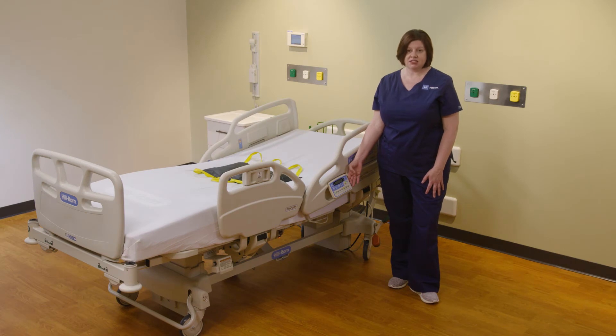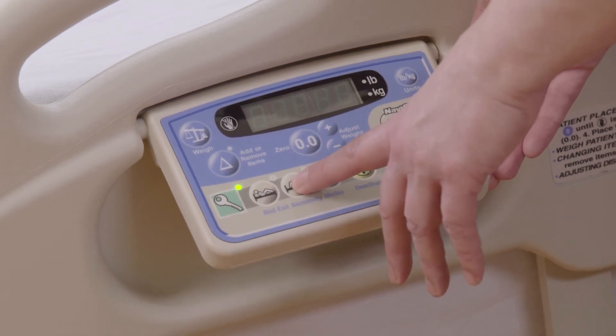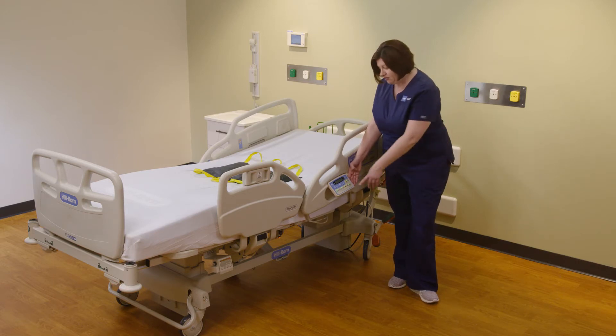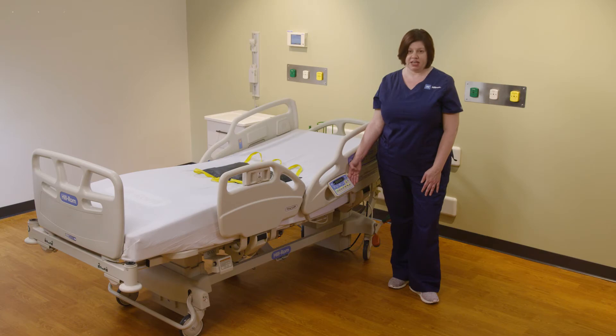To activate the bed exit alarm, simply engage the green key and select the setting appropriate for your patient. You will hear one audible chirp and you will see a visual indicator — the light next to that icon is illuminated to let you know the bed exit has been set.